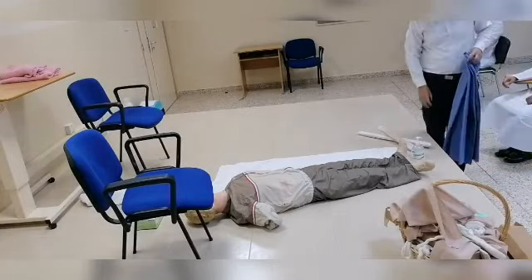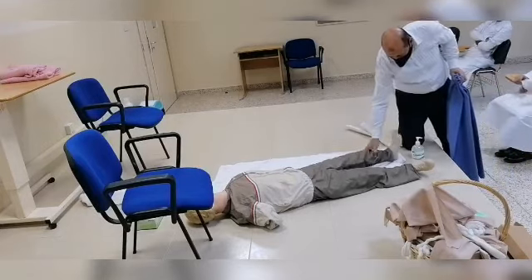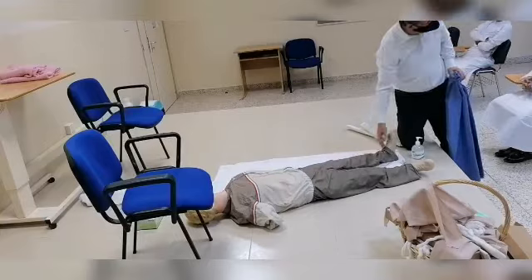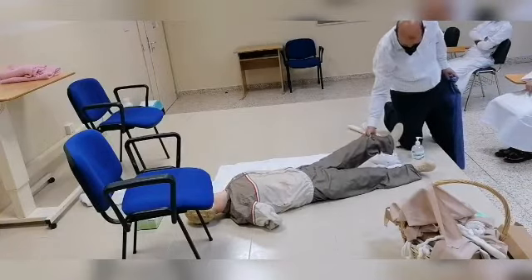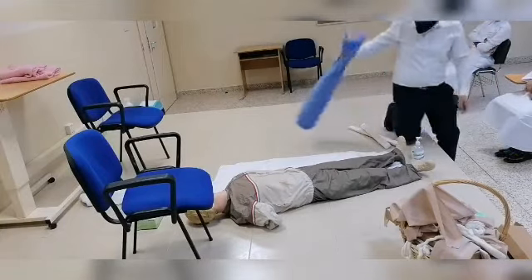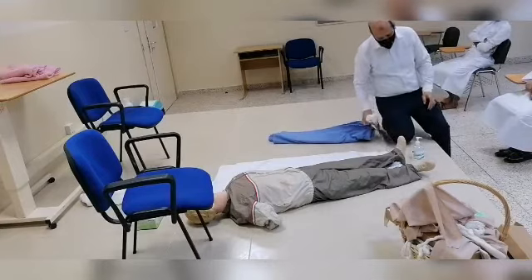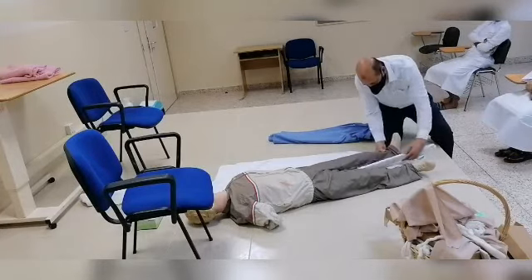If this patient is having a fracture in his leg, let us say that it is here in this part, I have to fix it first with a hard splint. I have got two pieces of wooden piece.